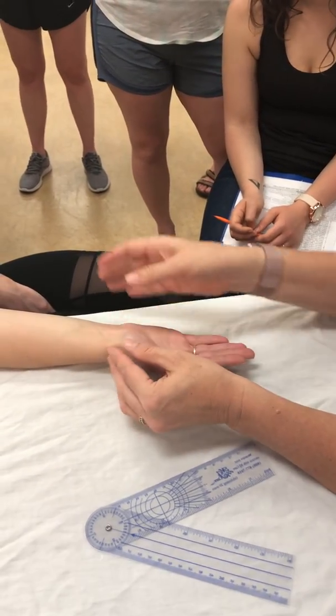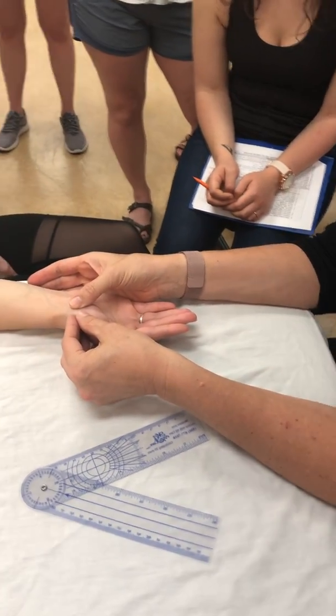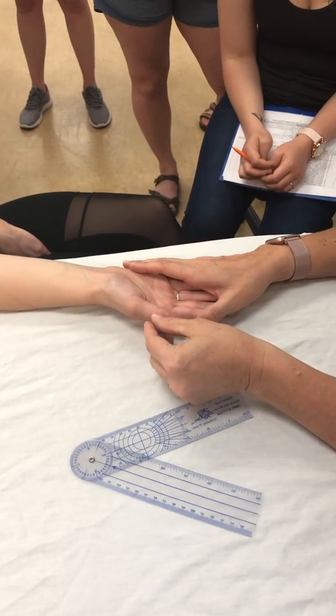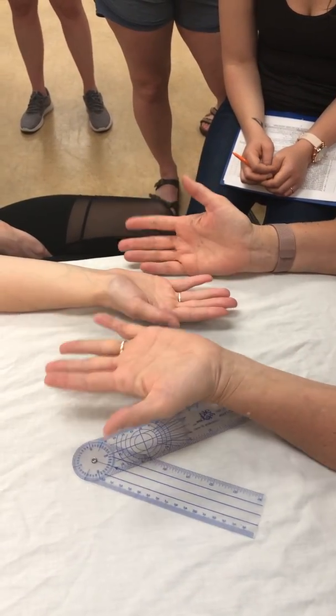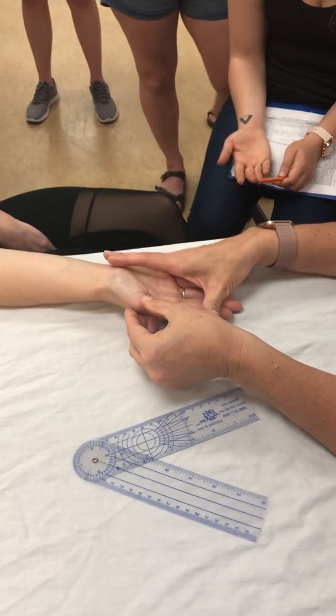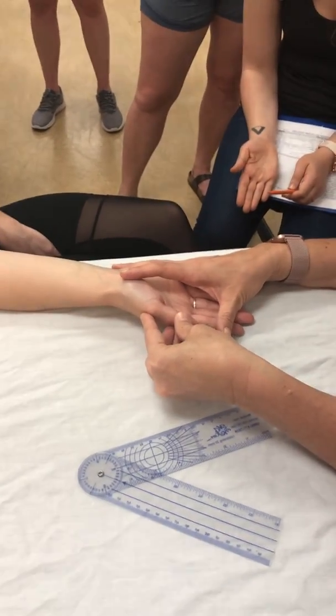Okay, so now we want to measure flexion and extension of the CMC joint. That was our other one. The question has come up now a couple of times. I think there was a group that was studying: is the natural position of the hand 0, or with the thumb adjacent to the palm? Anatomical position is the thumb adjacent to the palm, and so you want to put that person there.